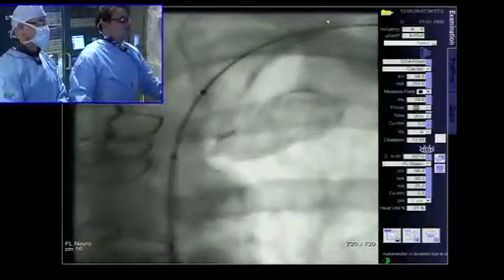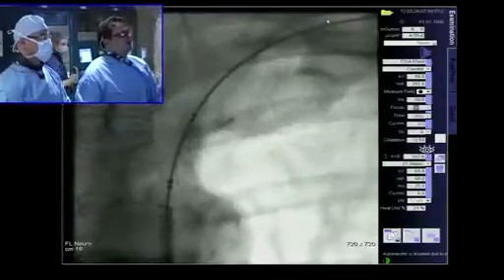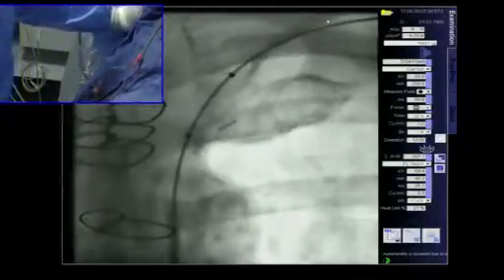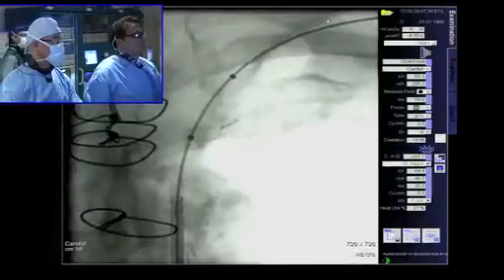A little dye, guys. And you see how it takes the... We still got a way to go here. So we're going to try to just slide it forward like right about there. Now we're going to have her take a deep breath. Senora, no respire. No respire. Inject.